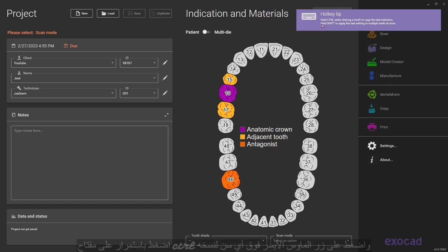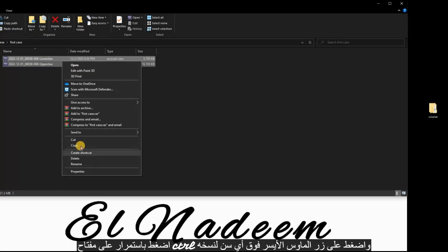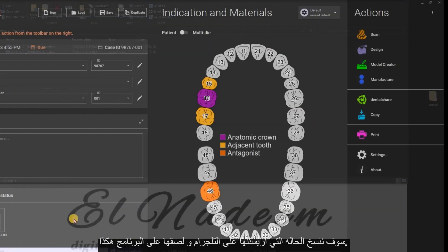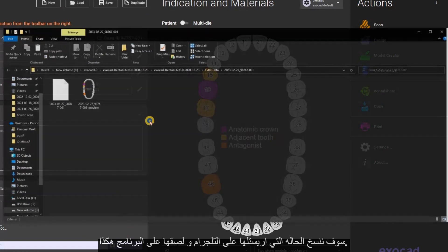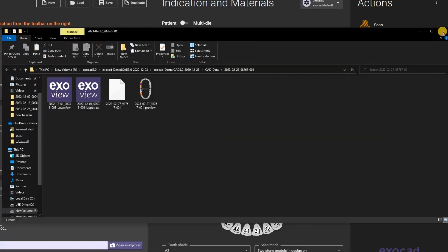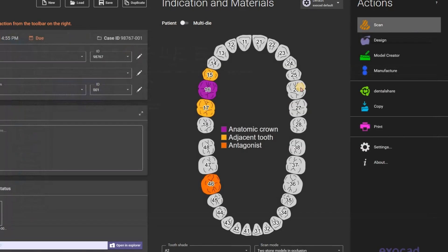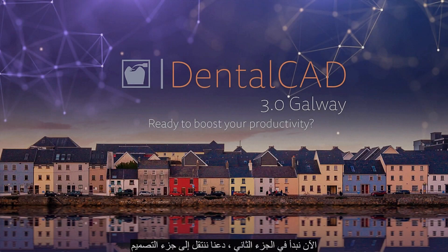Hold CTRL and press the left mouse click on any tooth to copy it. We will copy the case that I have sent on Telegram and paste it on this part. Now we are starting the second part — let's jump to design.